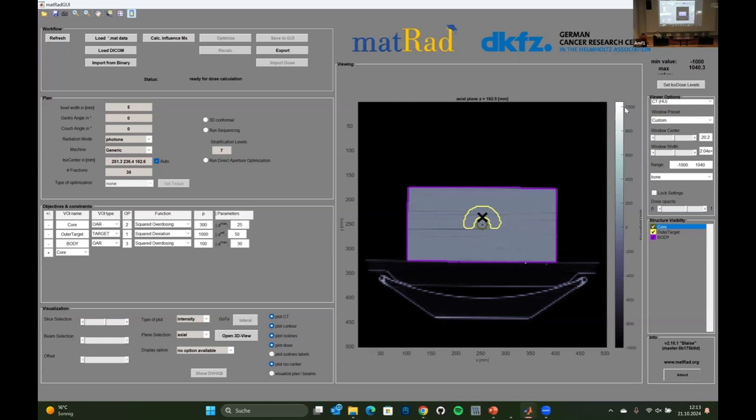Kind of an interesting side note, the historic reason for these units of -1000 is that floating point numbers were a little bit more difficult to use when the CT was invented. So to store values, you often used integers. And so this is a scale that was built as whole numbers from -1000, -999, and so on, where -1000 is air or vacuum.